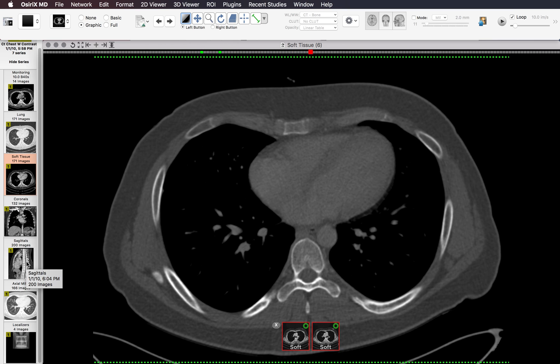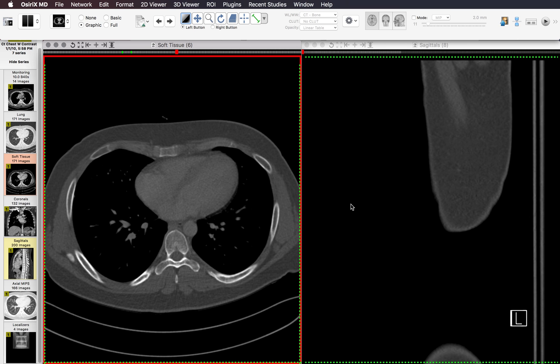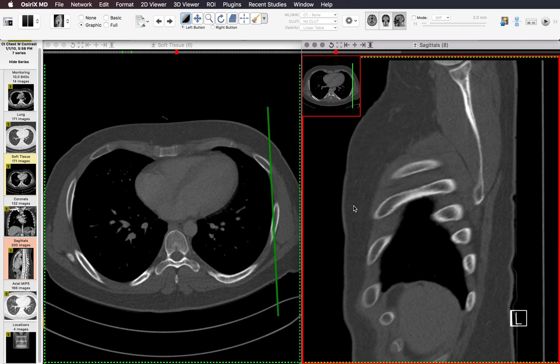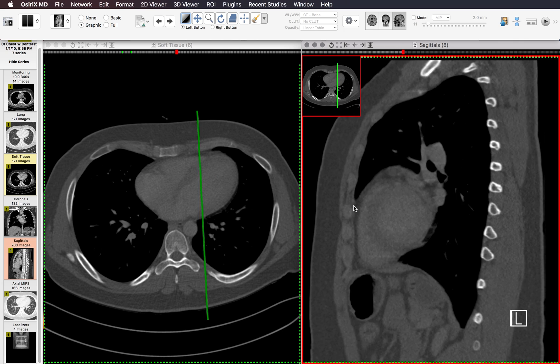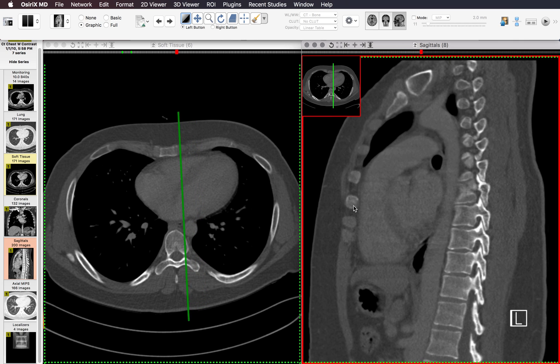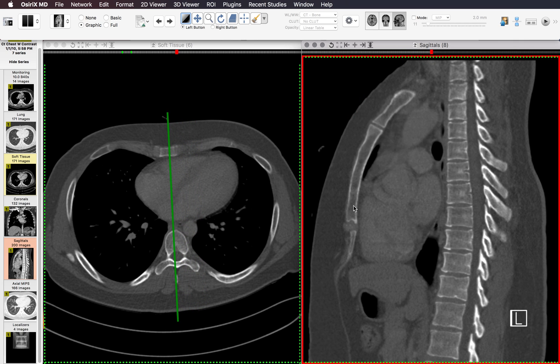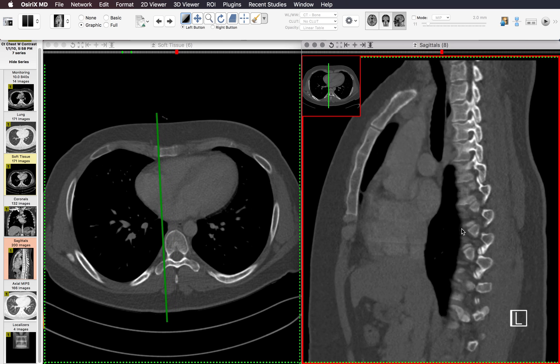Before moving on from bones, I look at the sagittal images to make sure there are no compression deformities that I missed on the axials. I look very closely at the sagittal images, especially in the midline, for any compression deformities or other abnormalities I may have missed.